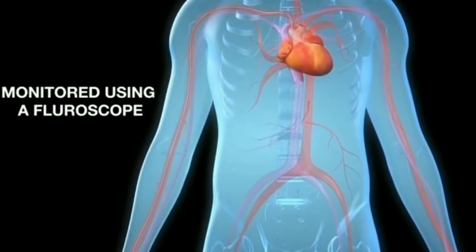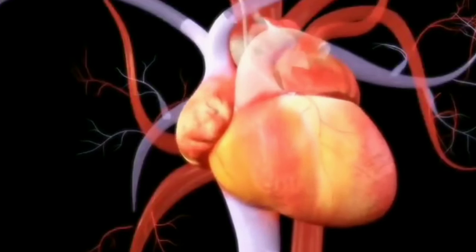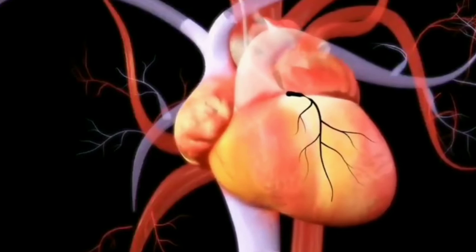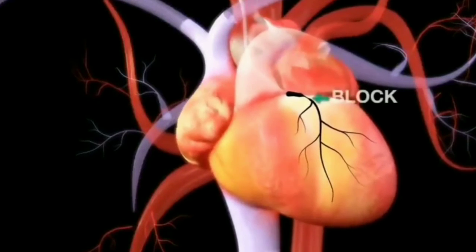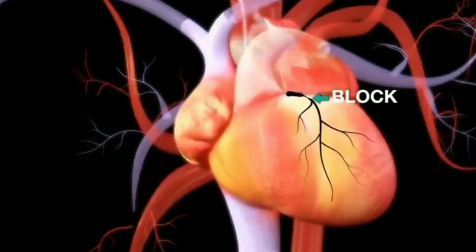In the procedure, before beginning the angioplasty, a healthcare professional will clean and numb the area where the catheter enters the body, usually the groin but sometimes the wrist. Next, a doctor inserts the catheter into the artery and directs it towards the coronary artery, watching this progress on an x-ray feed.